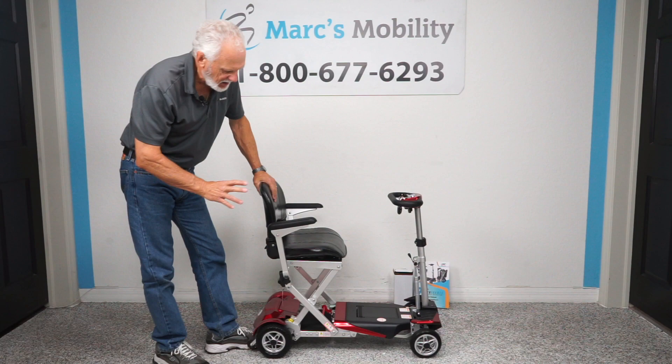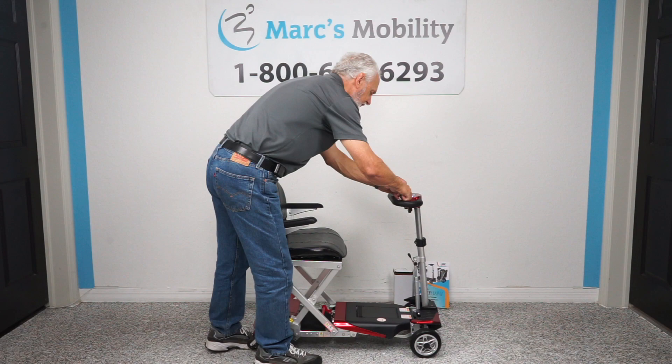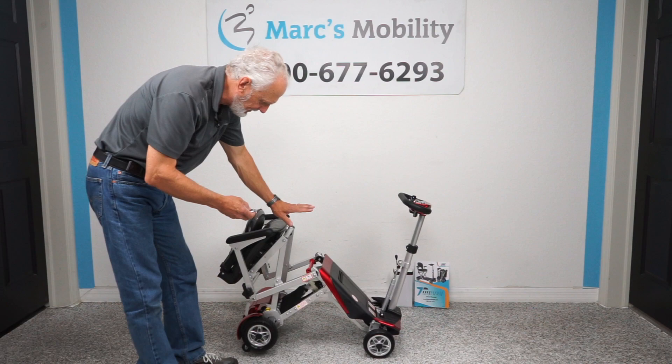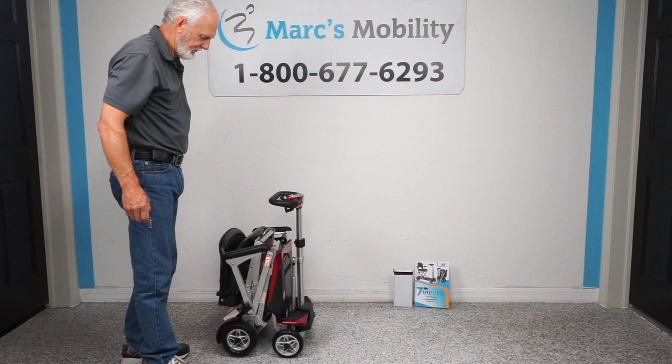If you want to fold this scooter, this is a self-folding scooter. You can use your key fob right here — I'm going to remove it. You just push the button once and you can see the scooter will start folding. It's a two-step folding, so it'll fold up and stop — that's in case there was something under there. Then you hit it again and it'll completely fold.